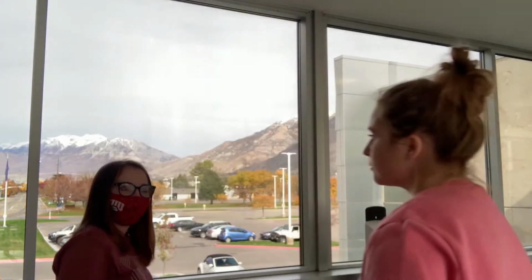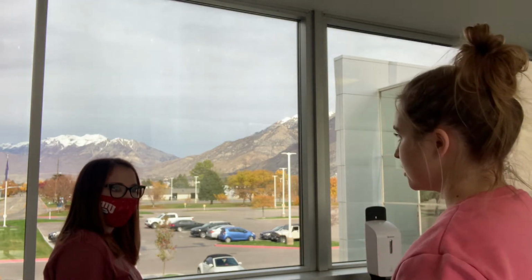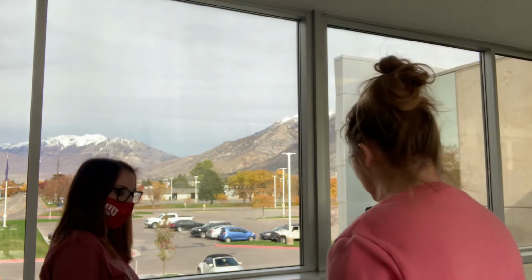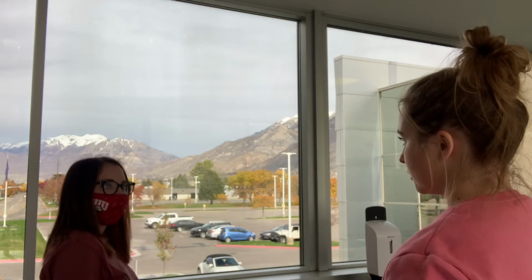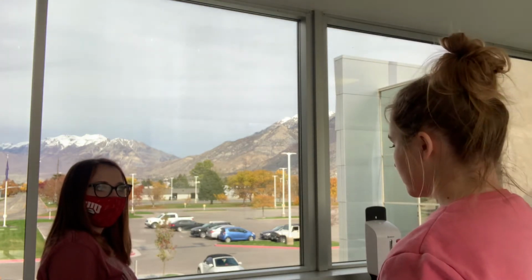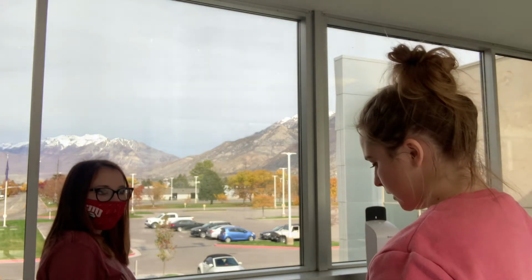Okay, Kayla, so now that we've worn you out a little bit from therapy, I know that knee is pretty sore. We're going to try what's called electrical stimulation. So we're going to be placing these pads on your knee, and they're just going to go right here and right here, and it'll help to alleviate some of that pain that you're experiencing from your osteoarthritis in that knee. So I think that it'll be really beneficial, but before we do anything, I'm just going to go through a list of contraindications. It's totally safe, but we just want to make sure you don't have any of these symptoms or anything.